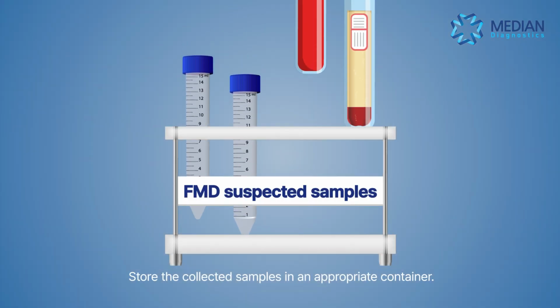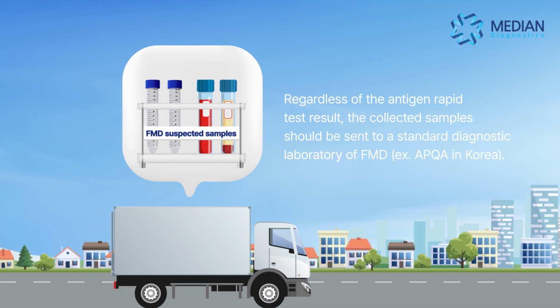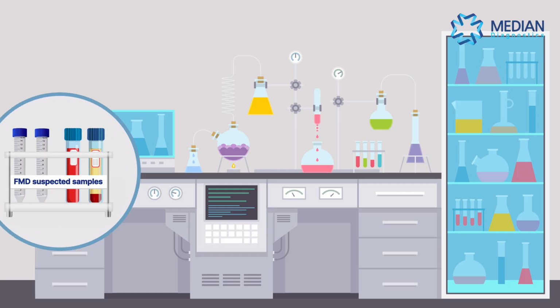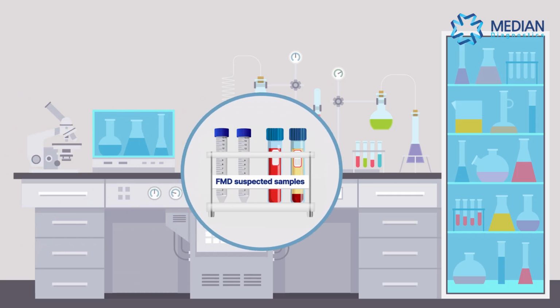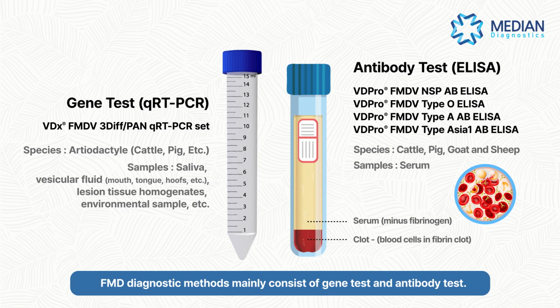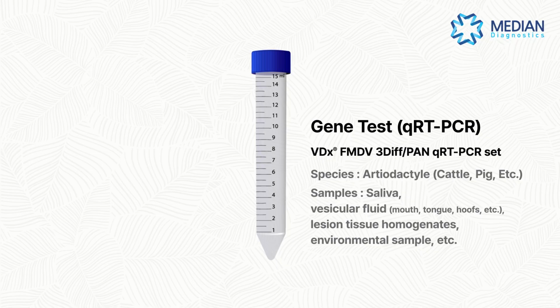The collected samples are stored in appropriate containers and sent to a standard diagnostic laboratory for FMD testing, regardless of the rapid test result. FMD diagnostic methods mainly consist of gene tests and antibody tests. First, let's introduce the gene testing kit.